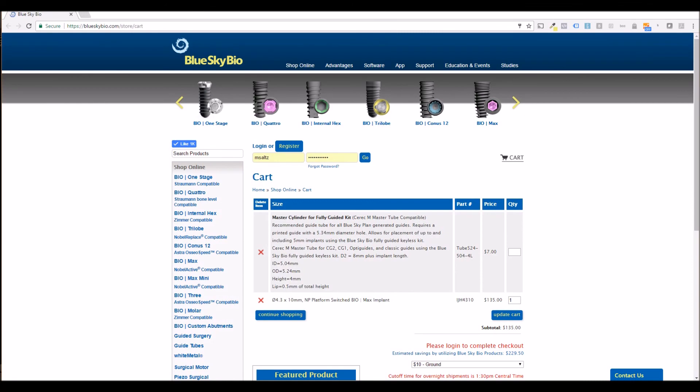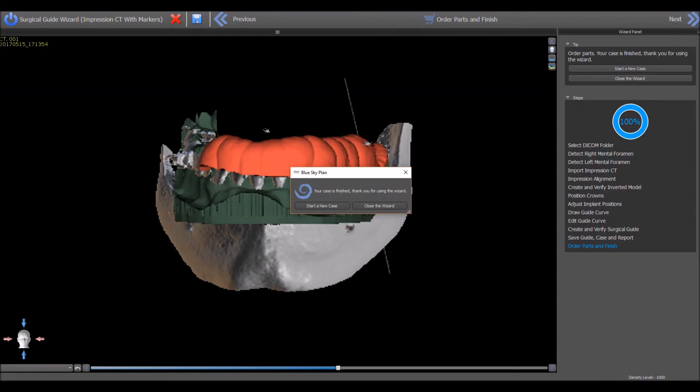Return to the BlueSkyPlan software and choose from the on-screen options to start a new case or to close the wizard.